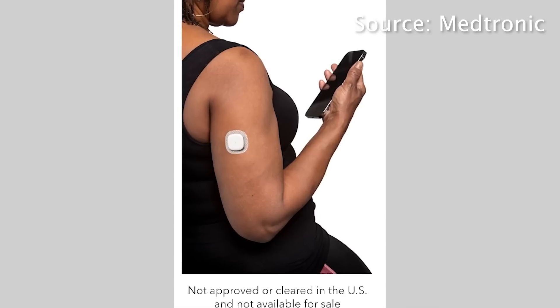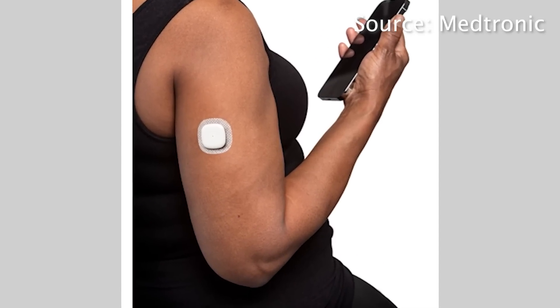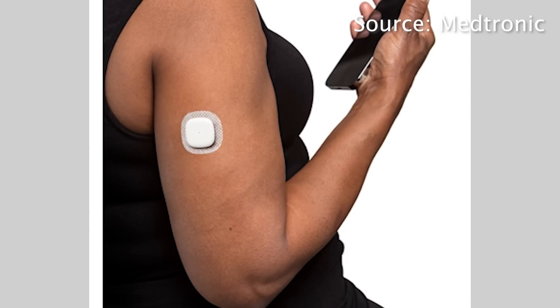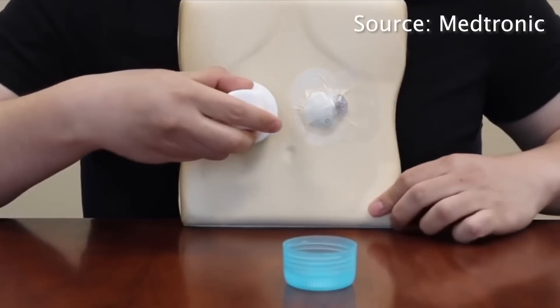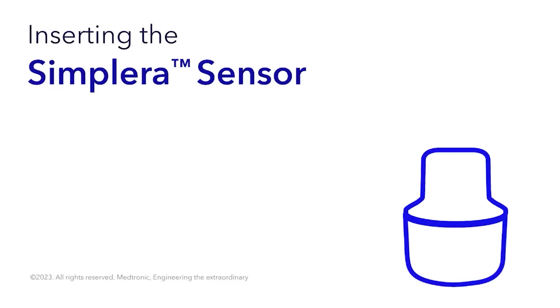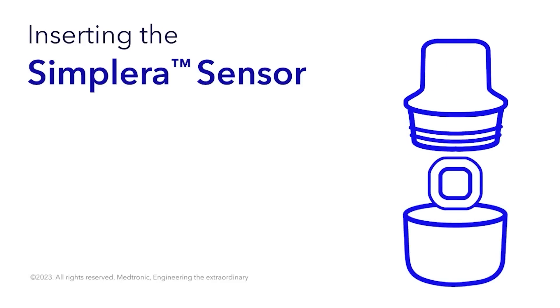First, let's start with Medtronic's new CGM, the Simplera. Simplera is Medtronic's first disposable CGM — much less of a burden than their Guardian system, because it's just like other systems where you use an applicator, put it on, and there you go. When you're done with it, you just throw it out. A little bit wasteful, but it is a much more sleek device and easier to use.